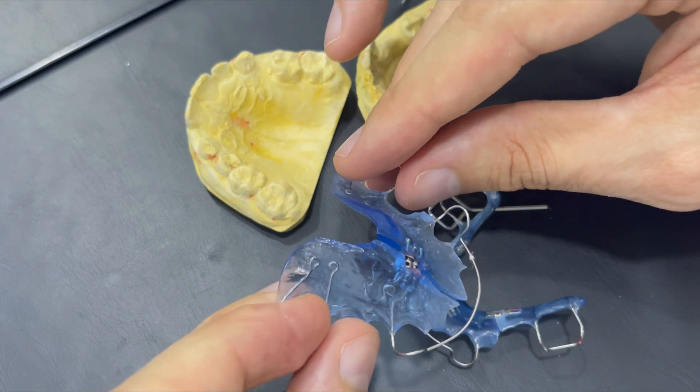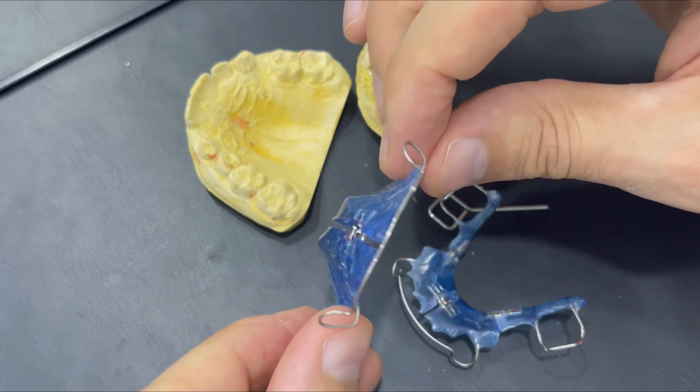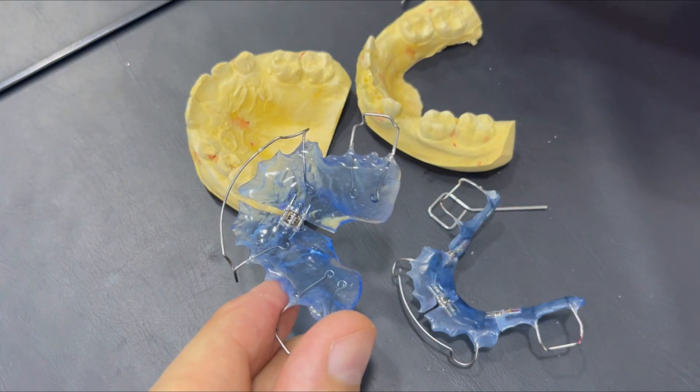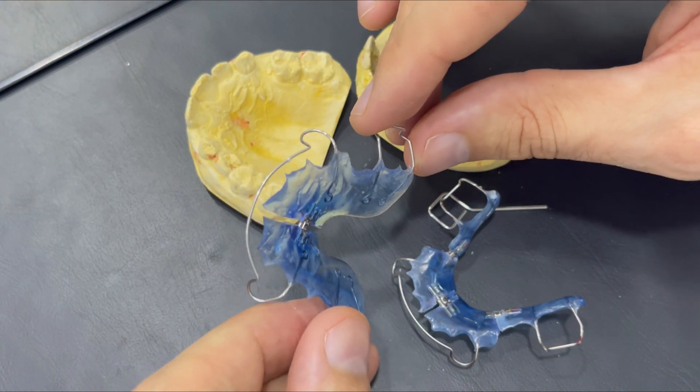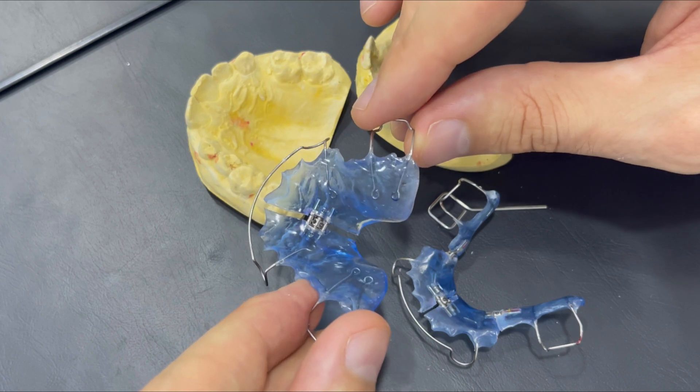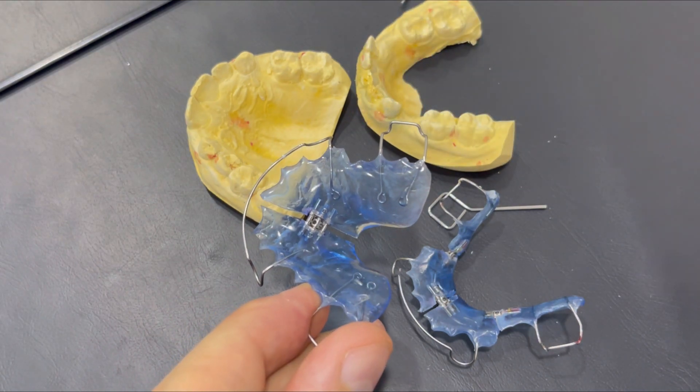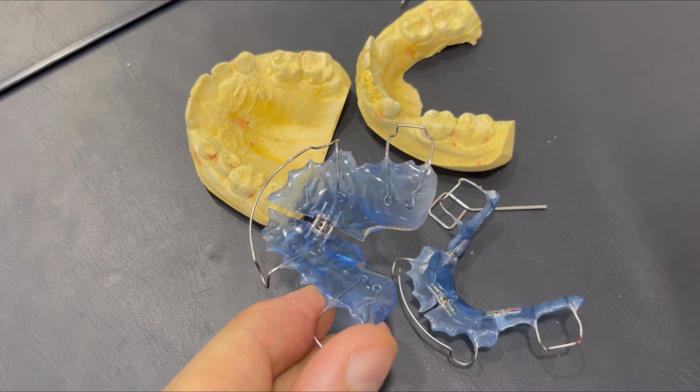Since the maxilla is connected directly with the nasal cavity, so creating more width to the maxilla is creating more space for the breathing. Because usually when the maxilla is narrow, the whole mid-face is narrow.